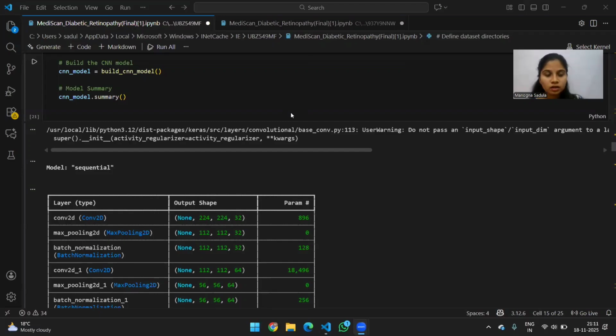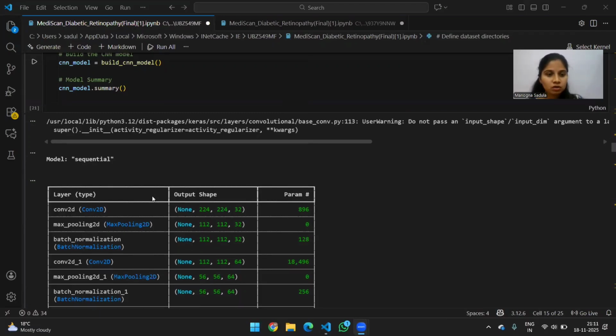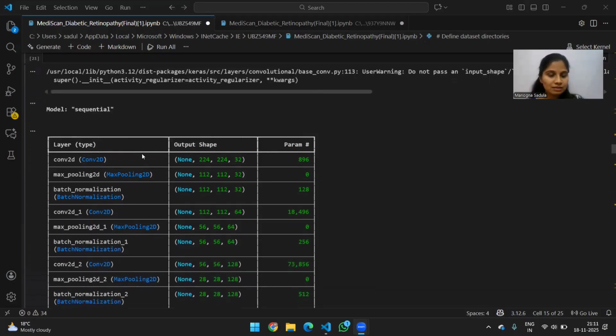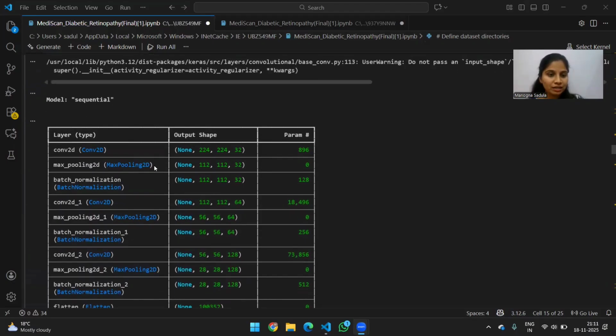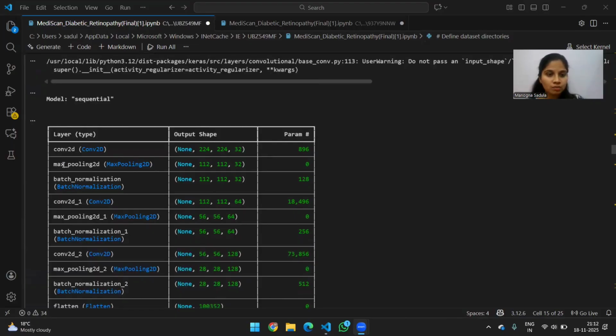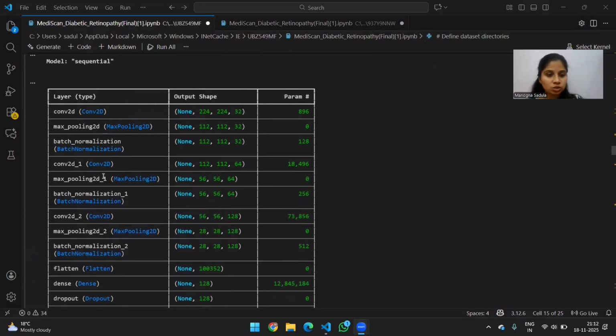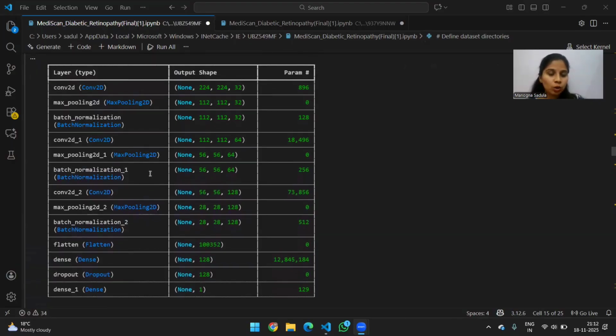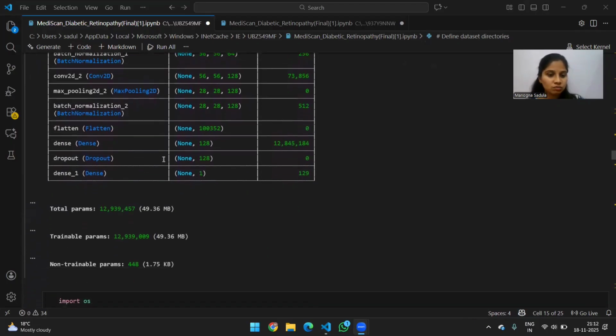Hi, this is Manogna. So here we are starting to build the CNN model. If you come down here, we have a table that says the CNN model summary that lists every layer of our neural networks, where we have Conv2D, max pooling, batch normalization, flatten, dense, dropout, etc. And this table overall describes the full architecture of our DR detection model.